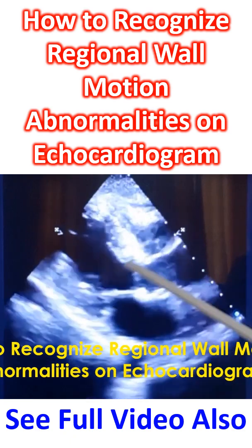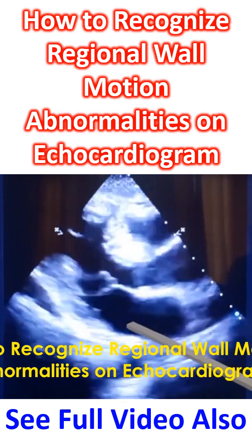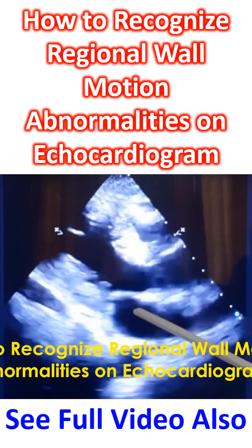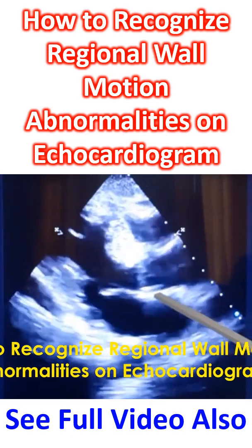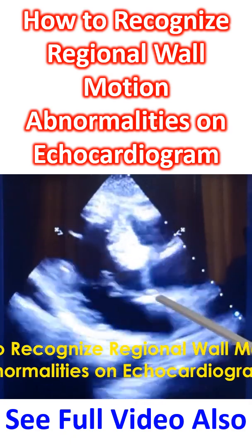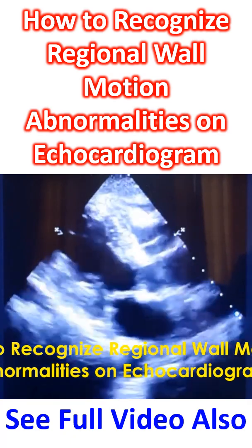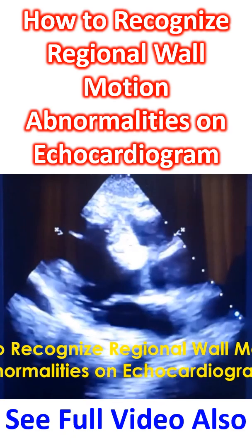This is the parasternal long axis view, usually the first view taken during echocardiography. To recognize regional wall motion abnormality, you compare the motion of different portions of the left ventricle.